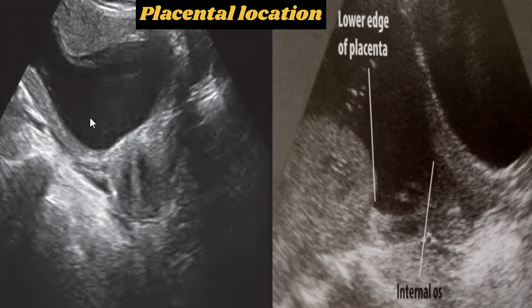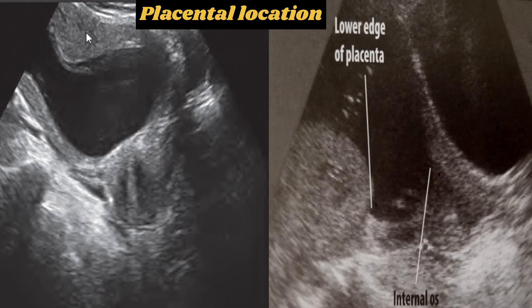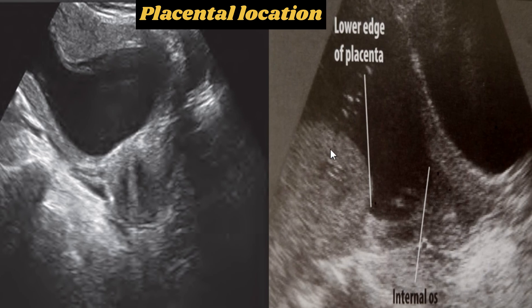Now we are going to discuss the relationship of the placenta to the internal cervical os. This is the longitudinal transabdominal image of the gravid uterus. The placenta is present anteriorly and away from the cervical os. In another image, the placenta is present on the posterior wall, just at the margin of the internal cervical os — this type is called the marginal placenta. The bladder is also visible in the sonogram.